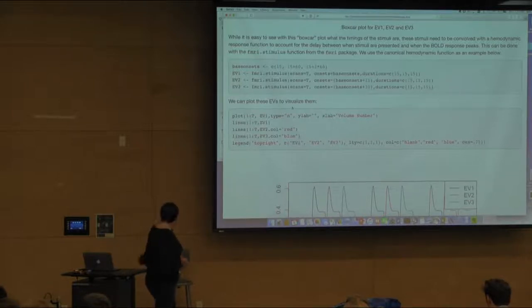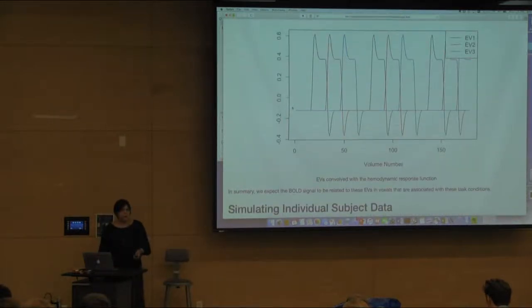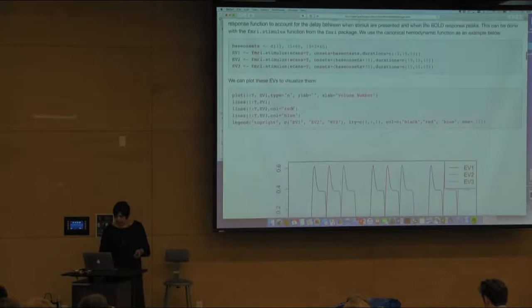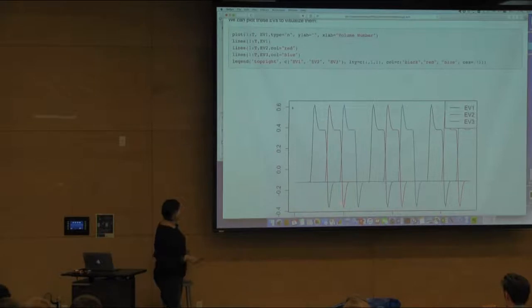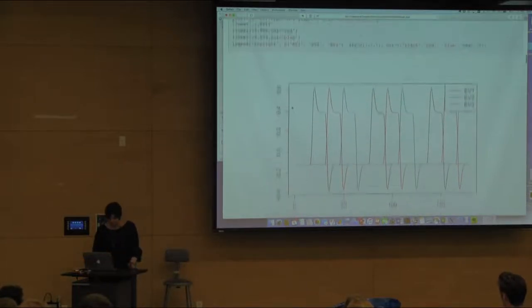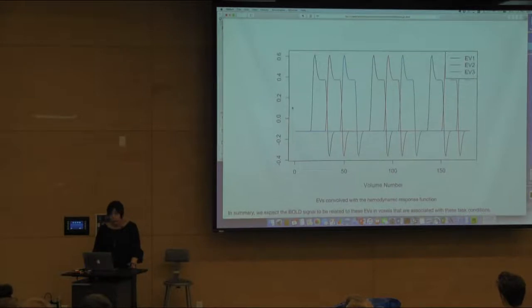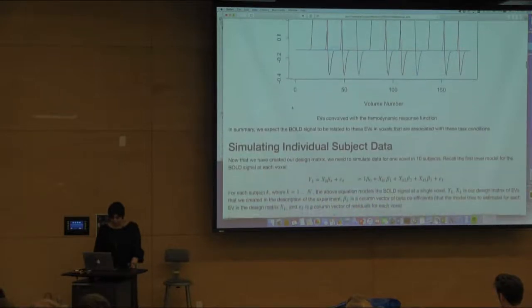And then similarly, we can plot these to visualize these. So, and we've got that, right? So this is a hemodynamic response function. I believe it's the default one, canonical. There are different ones, where I was surprised when I saw this that their drop-off is so high, relatively speaking. I've not seen that typically, but I don't know if you know what your hemodynamic response function looks like in the software that you use, but that's something that you can choose. Or many software packages have support for a set of basis functions that you can use to match whatever it actually is, or at least come close to that.